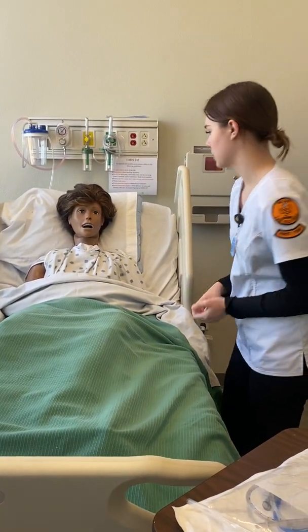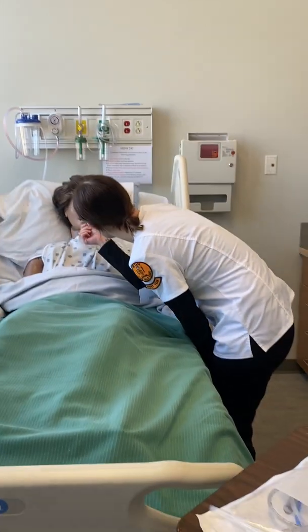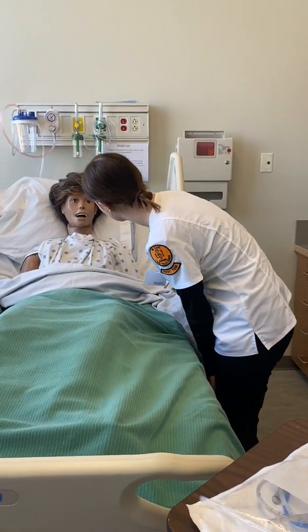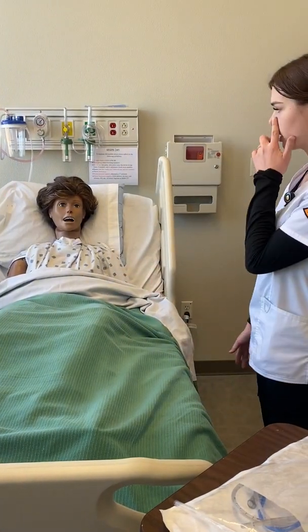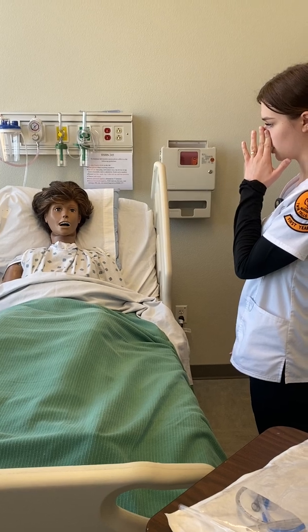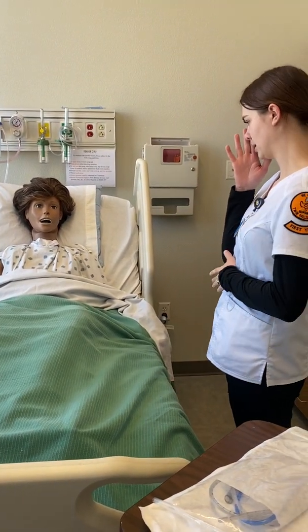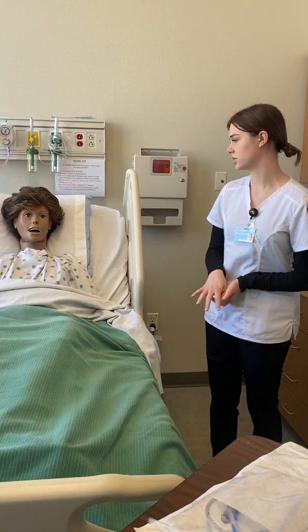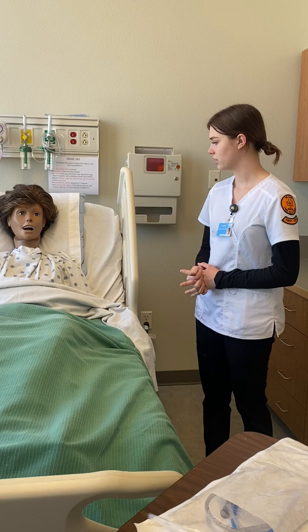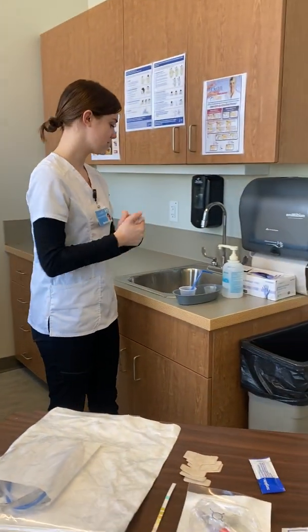All right. I'm going to go ahead and just inspect your mouth, looking inside. If I had a pen light, I could use that to get a better look. And then I'm just going to have you cover one side of your nostril and just breathe out through the other one. Good. And the other. All right. We're going to go ahead and insert it in your left nostril today, if that's okay with you. Perfect. All right. Let's just wash my hands. We're going to go ahead and get started.